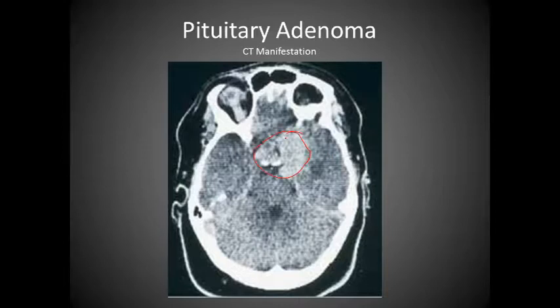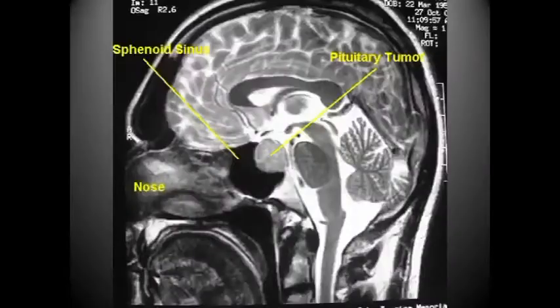Here's a pituitary adenoma in terms of CT. As we can see, due to going through the base of the skull, it becomes quite difficult to discern where we're actually at and what we're looking for. But probably this person has had an MRI, and we're doing a CT as well, just to get a full picture of the patient.